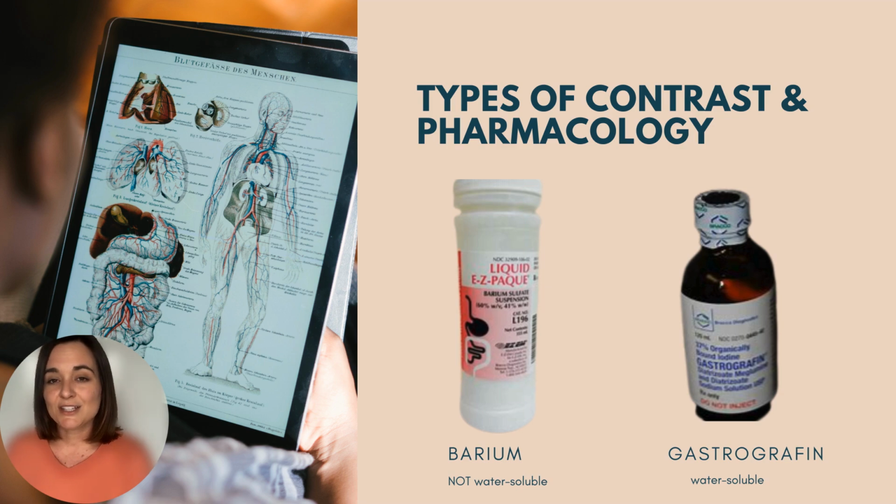All right, let's look at ionic versus non-ionic iodinated contrasts. They come in two varieties. Your ionic puts you at a higher risk of reaction. Your non-ionic is safer, but it is more expensive. For GI procedures, water-soluble agents tend to be ionic, but always check your site's protocol before you push anything.